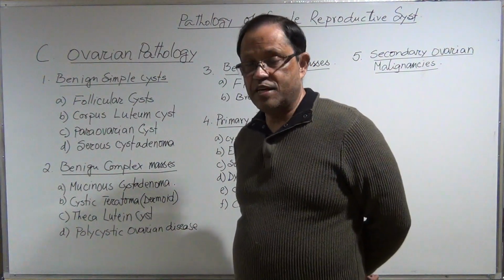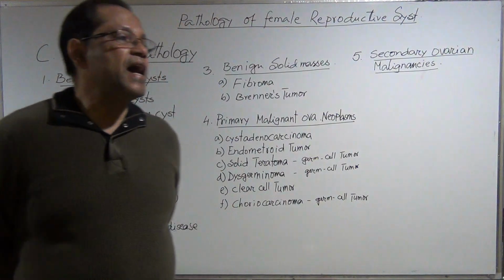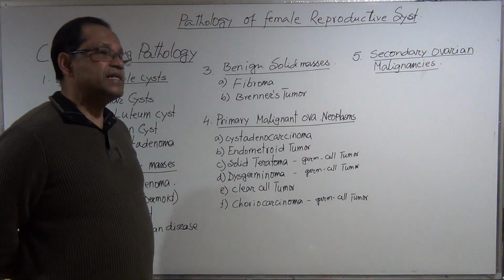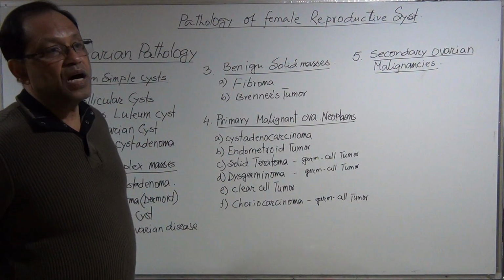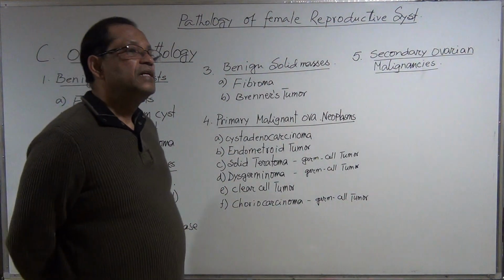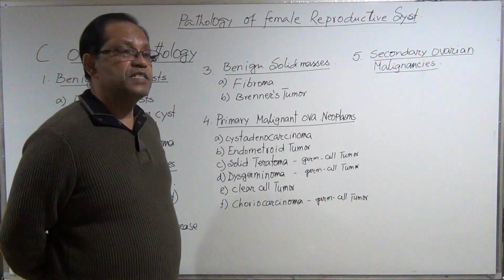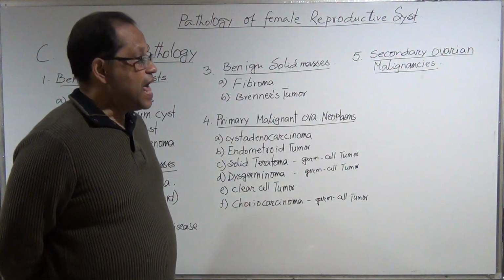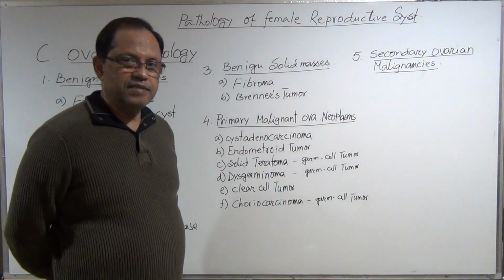Do I need to check the endometrial thickness, uterus? Yes. Because you can understand the patient is in the ovulatory phase by looking at the size of the follicle, taking the history of LMP, that is the first day of the last period, and by looking at the endometrial thickness.